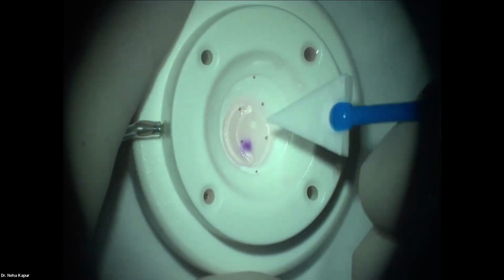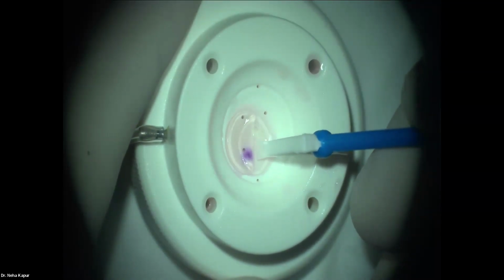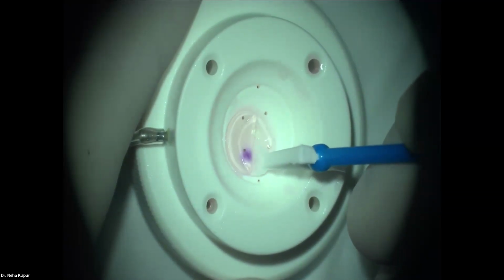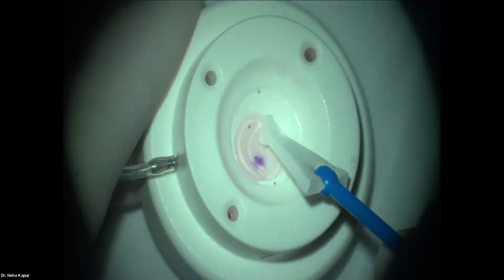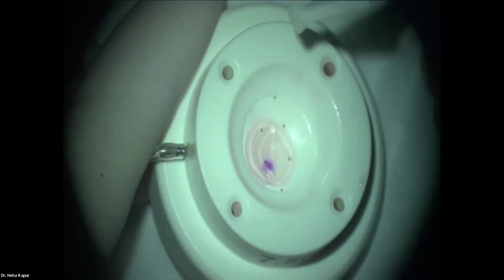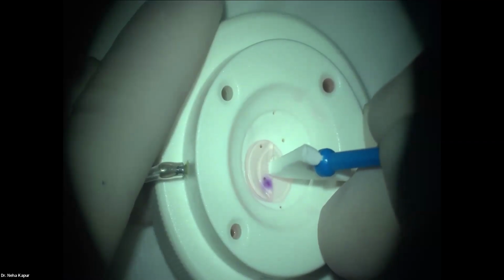We then take a Miracell sponge and dry out on the stroma. The lenticule, the endothelium is here on top, that's not the part we are touching. Do a gentle dab here on the lenticule because we want a dry bed for the mark. From the periphery, as much as possible, dry out whatever can be taken out so that you get a good, reliable mark. This is a step which I feel is mandatory and should never be compromised.